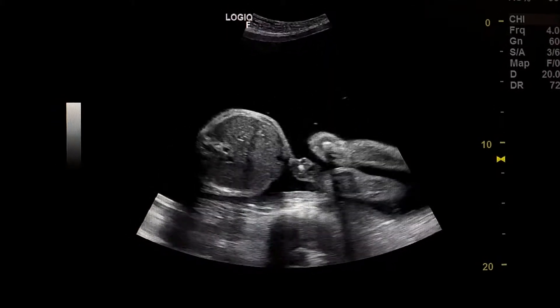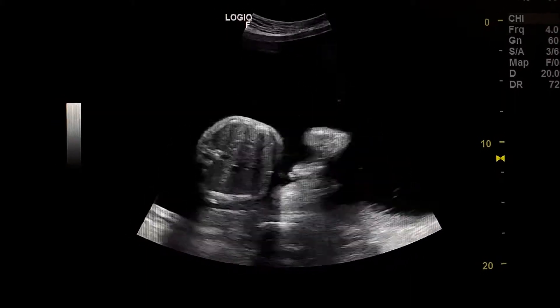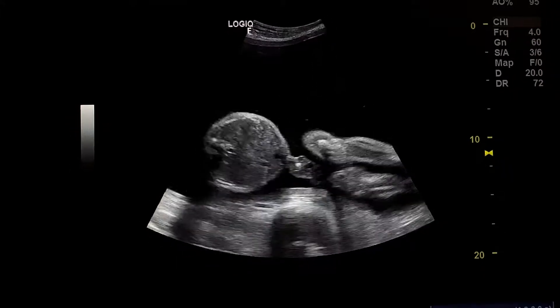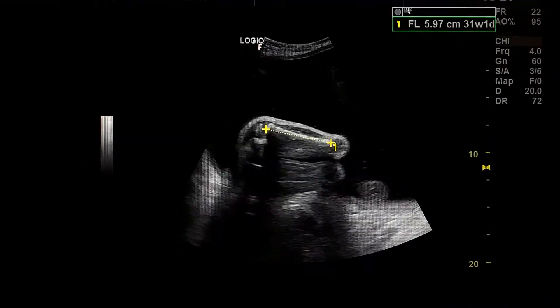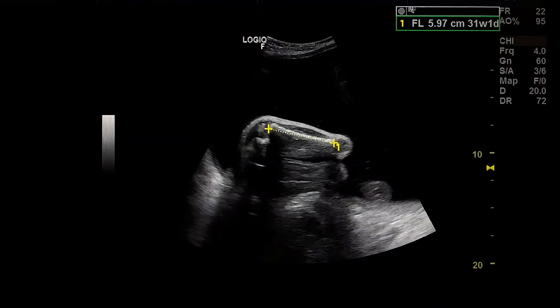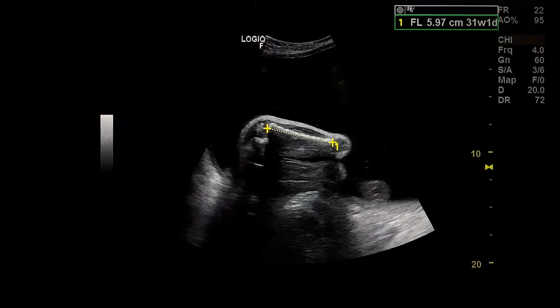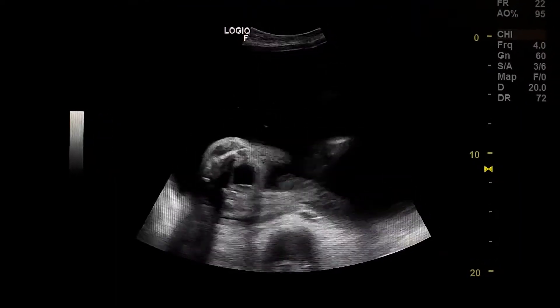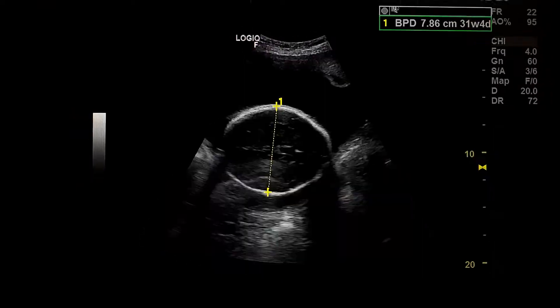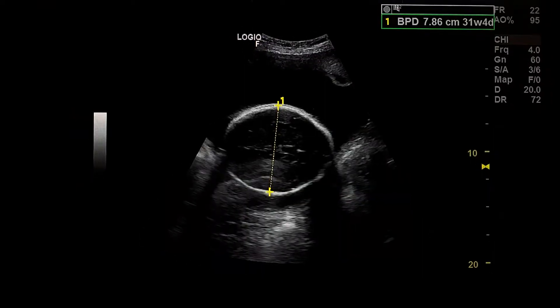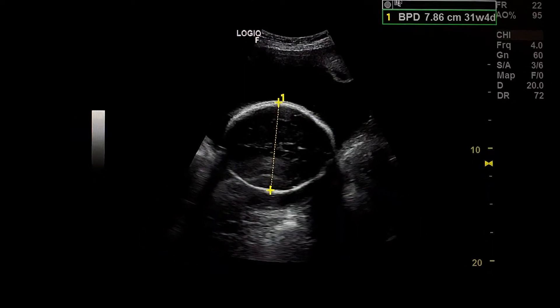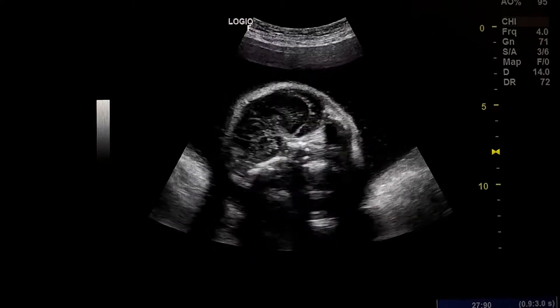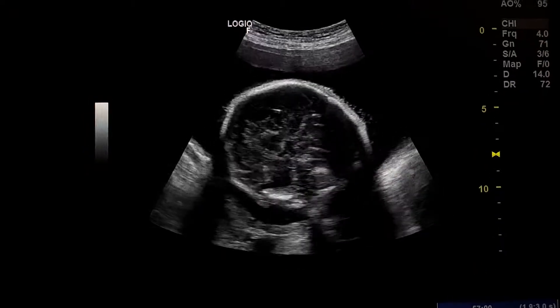Umbilical cord insertion is normal. FL is 31 weeks 1 day. Gender is female. BPD is 31 weeks four days. Normal brain.